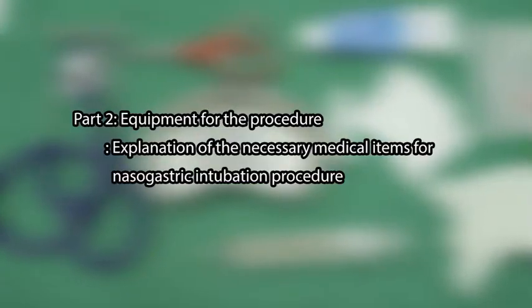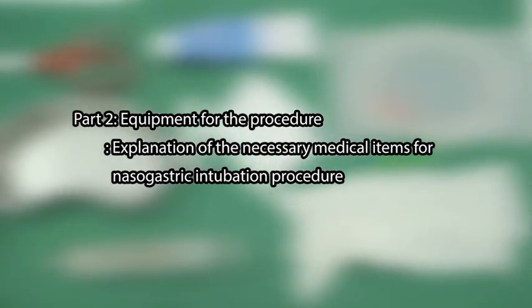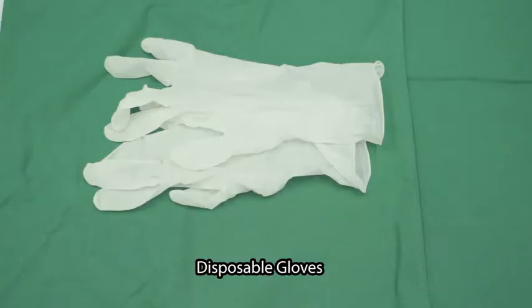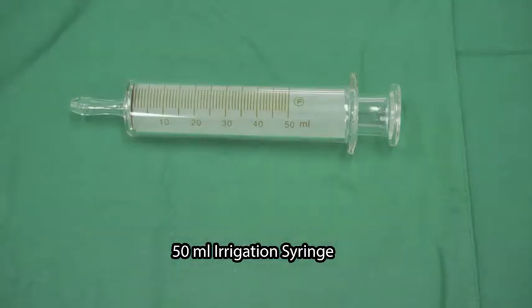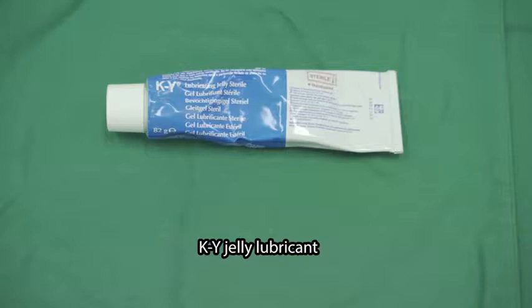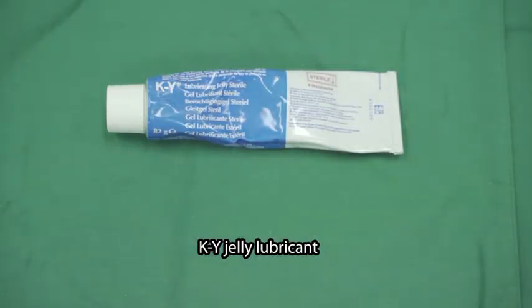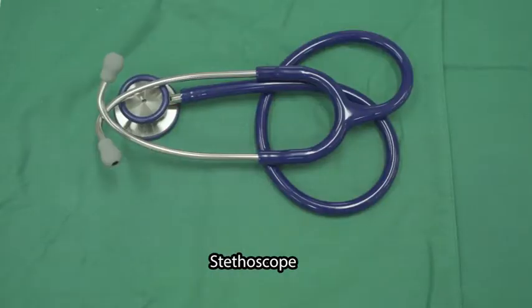Part 2. Equipment for the procedure. Explanation of the necessary medical items for the nasogastric intubation procedure. 1. Disposable gloves. 2. Nasogastric tube, number 14 for feeding and number 16 for decompression. 3. 50 ml irrigation syringe. 4. Kidney bowl or kidney dish. 5. KY jelly lubricant. 6. Gauze. 7. Micropore. 8. Scissors. 9. Stethoscope.